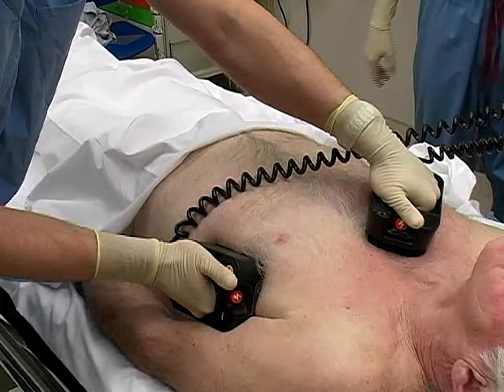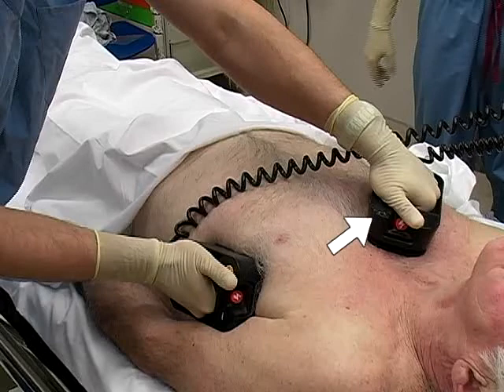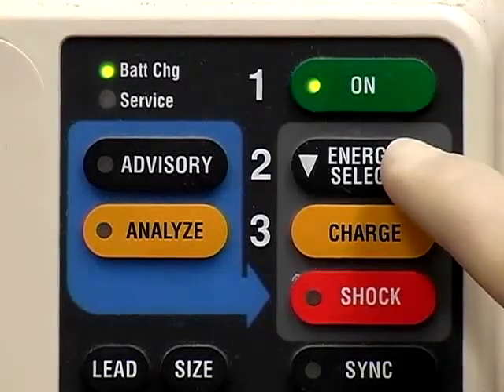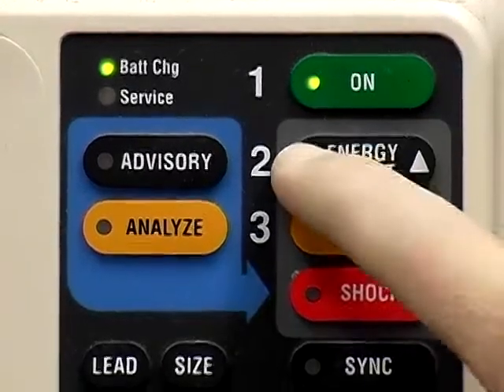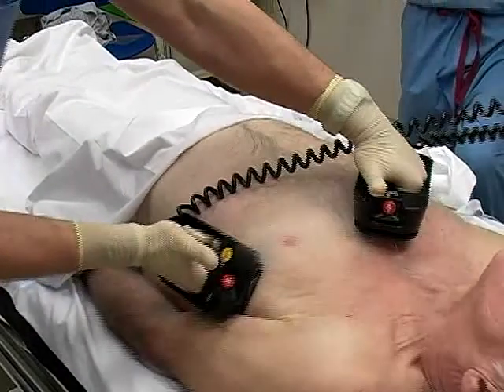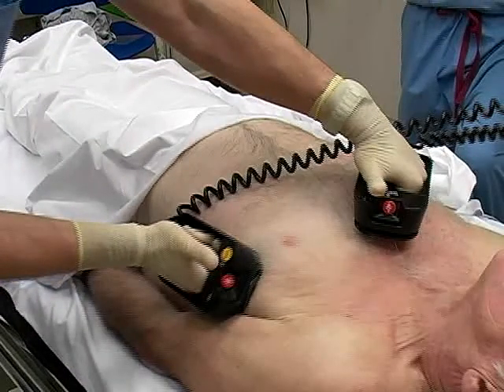To cardiovert, follow the same sequence as described in the previous section. Note that energy select, charge, and shock buttons may be found on the paddles, or an assistant can push the buttons on the front panel of the machine. To discharge the energy, push the shock buttons on both paddles simultaneously.